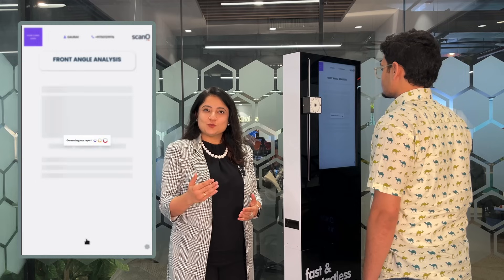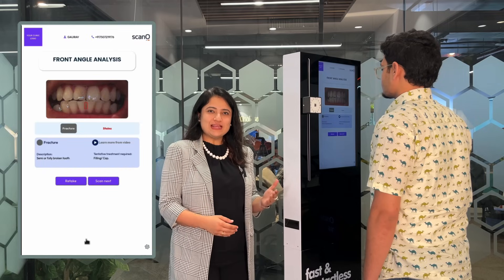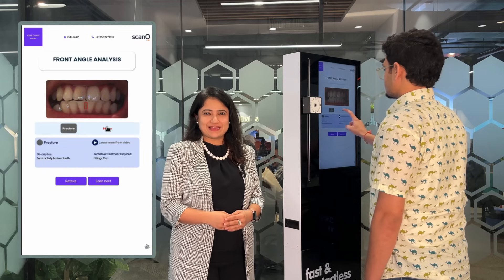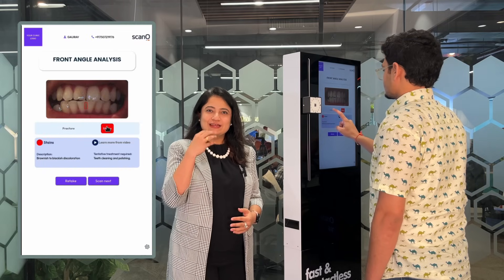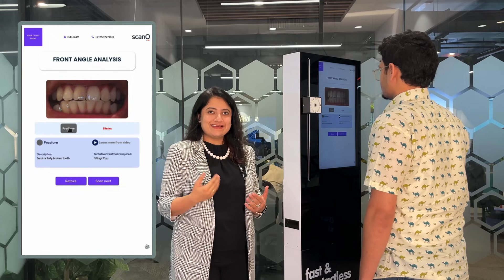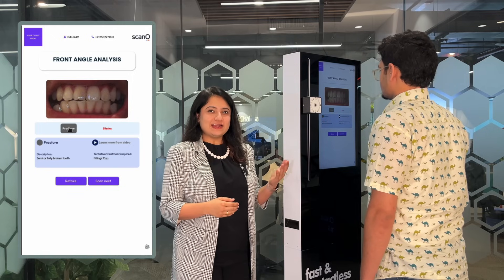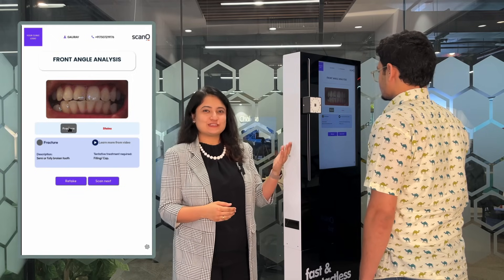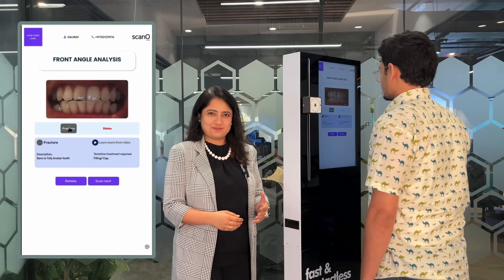You just witnessed three layers of AI: detection of mouth, detection of jaw, and then detecting findings on the patient's front angle.